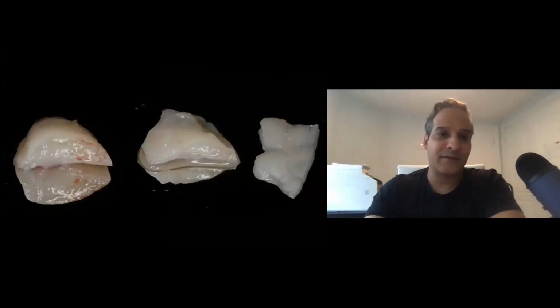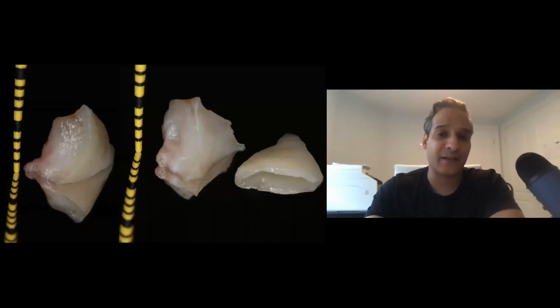Now here, the same thing. This is another tuberosity tissue. This is just a chunk right off the top. And then the 2 images on the right are basically the epithelium removed off the top. And so again, this is, you know, really nice for using as a graft material to create papillas, actually.